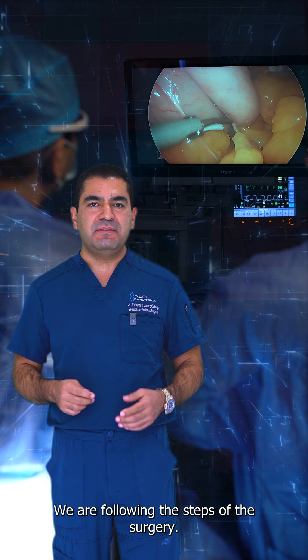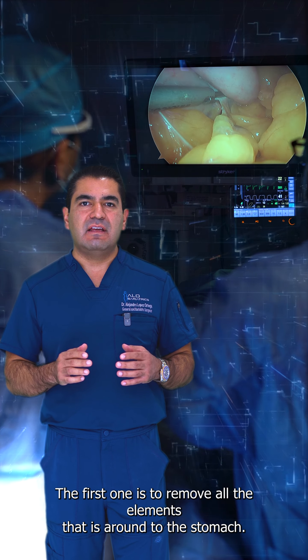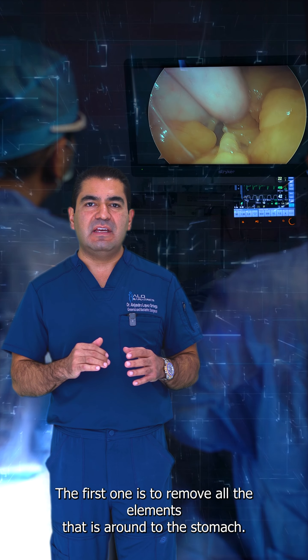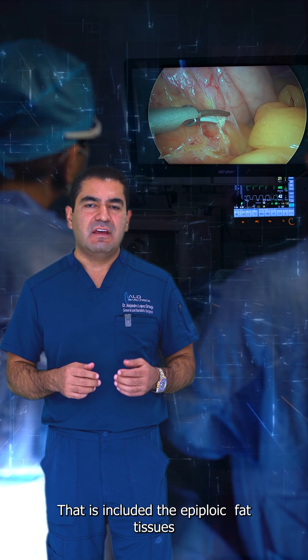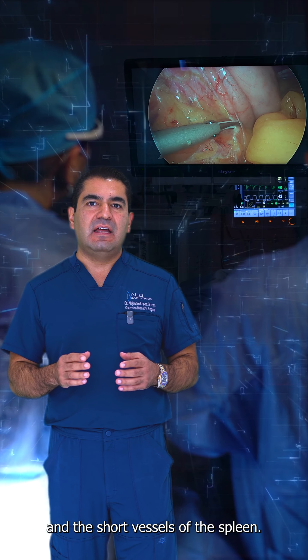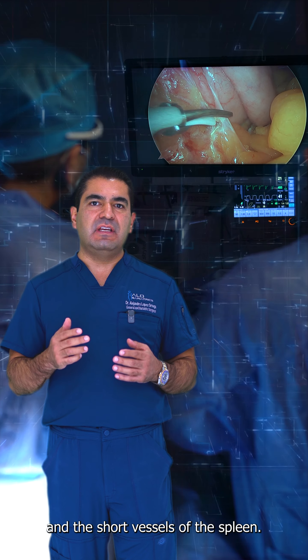We are following the steps of the surgery. The first one is to remove all the elements that are around the stomach, which includes the epiploic fat tissues and the short vessels of the spleen.